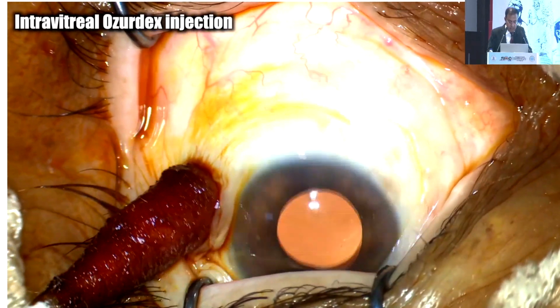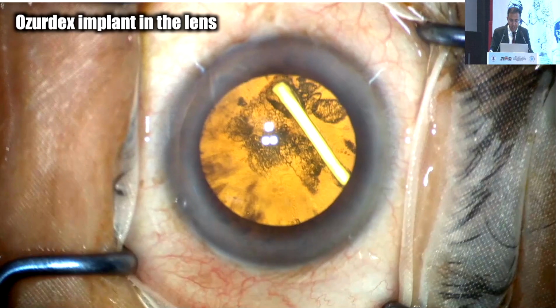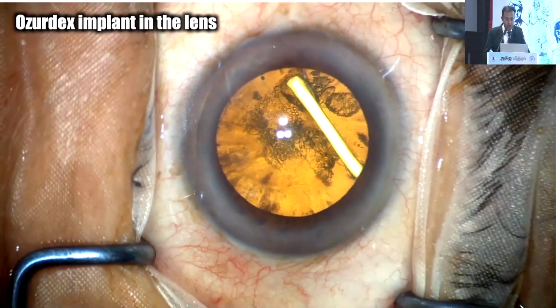Once we've done this. Now, I had a very interesting patient who visited me about 15-20 days back, and an anterior segment surgeon who did Ozurdex injection for the first time did something like this. During the injection, the Ozurdex went into the lens. And now I was worried whether it is a PCR or is it from the side. Though when I was looking at the slit lamp, it appeared that there is no PCR, but probably from the side, the Ozurdex has come inside. And I was prepared with vitrectomy and everything, but however, I was lucky that everything went on very smoothly.